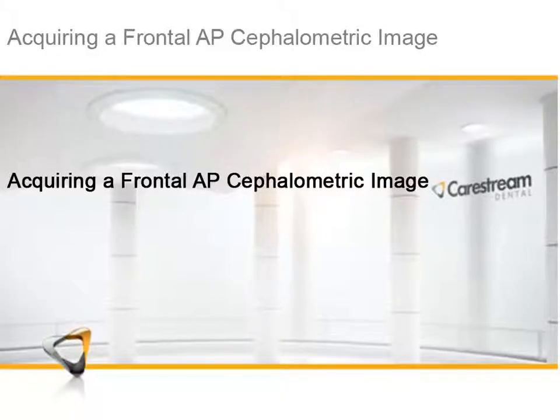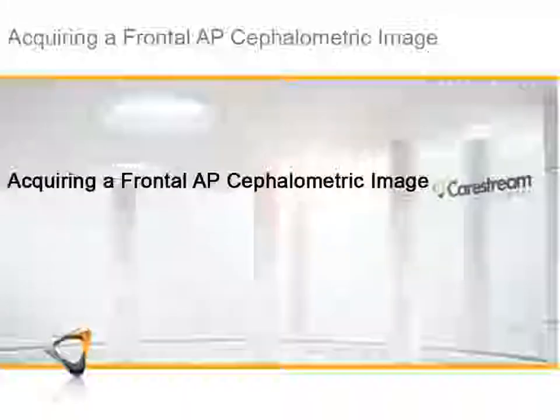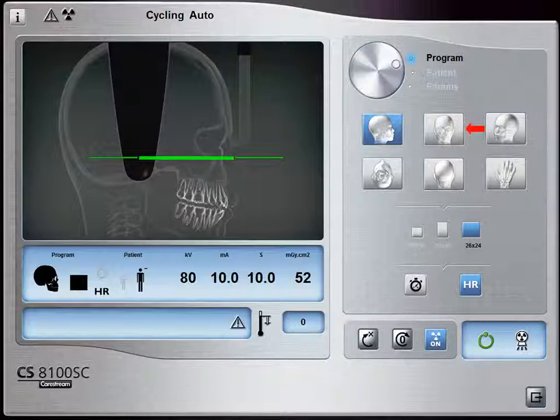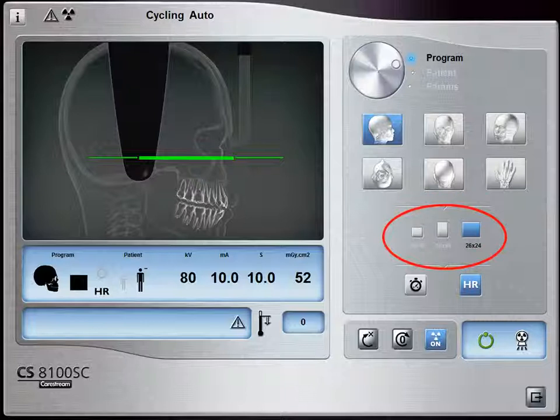Acquiring a Frontal AP Cephalometric Image — Acquisition Interface Settings: Position the head clamps parallel to the cephalometric sensor by turning the clamps to the left. In the Cephalometric Acquisition window, select the Program button to access the program pane. In the program pane, select the button for a frontal anterior to posterior AP exam. Select the appropriate Acquisition Format size.